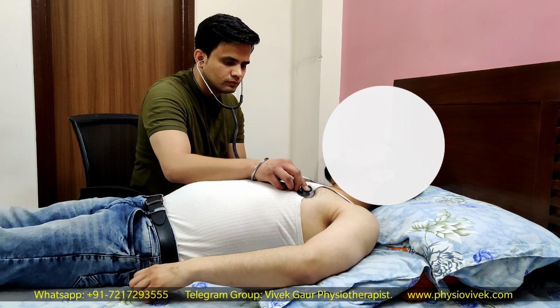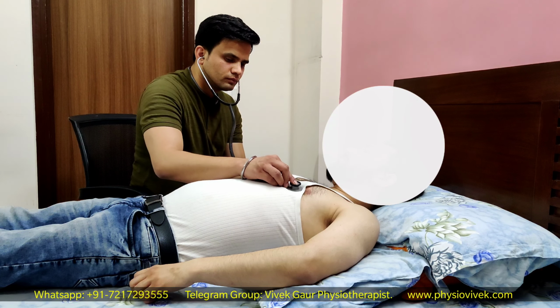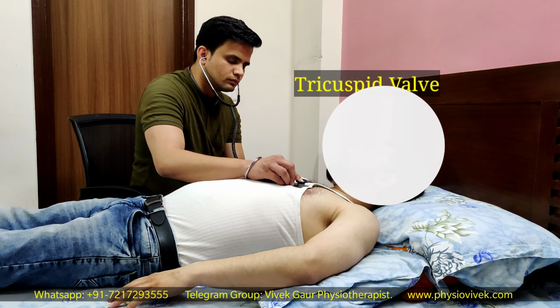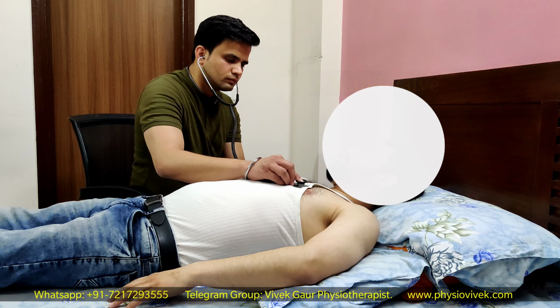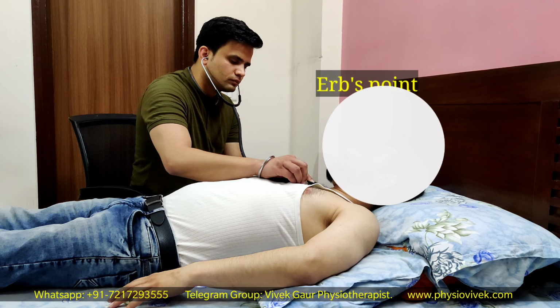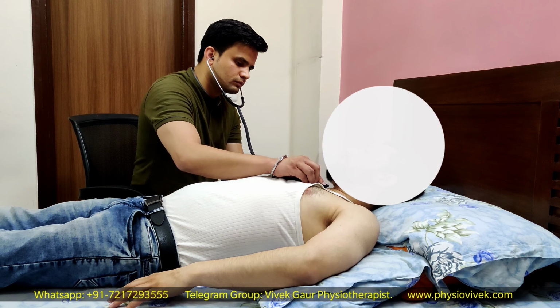After this, you move to the 4th intercostal space, where you listen to the tricuspid area, the tricuspid valve. Then you move one space up, which is the 3rd intercostal space, where you listen to the Erb's point, where all normal and pathological heart sounds are heard.